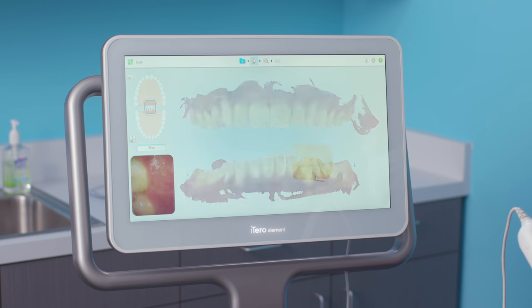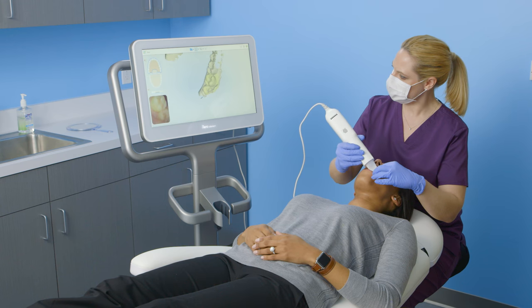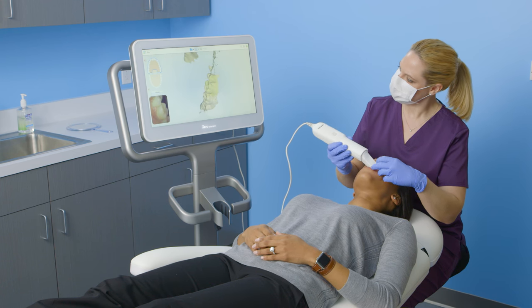In the bite segment, I only need to capture 3 to 4 teeth and the upper and lower gingival tissue. I do not need to wait for the bite to attach to the digital model before moving to the contralateral side. While scanning, I focus on the model on the screen, so if it stops building, I can quickly go back to the last area that was captured.